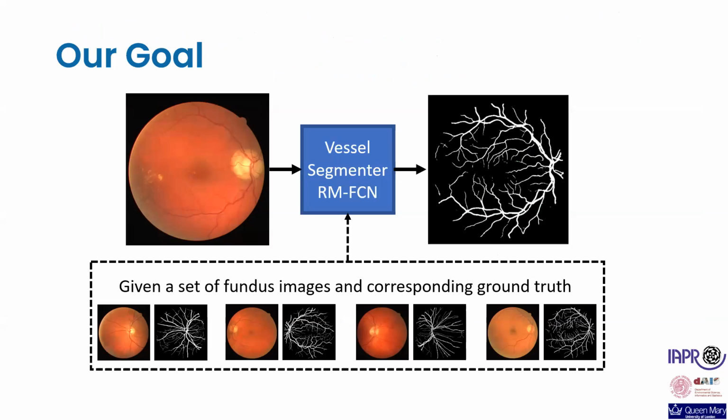Our goal is to come up with an automatic vessel segmentation method that can address the problems related to vessel segmentation, and should effectively detect vessels under varied conditions of optic cup and optic disc, should be able to detect tiny vessels, and should not falsely detect these pathologies as vessels.